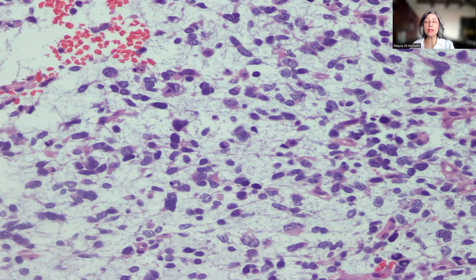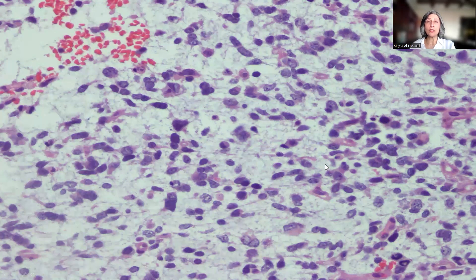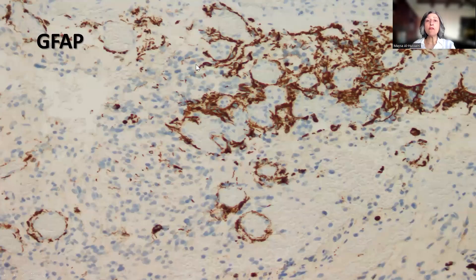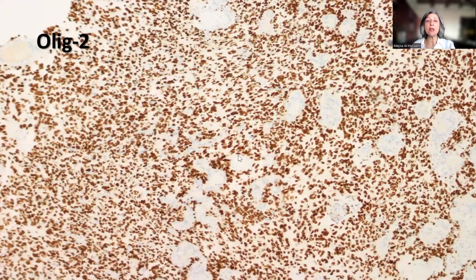There wasn't evidence of necrosis in this tumor, but remember, you do not need to have necrosis if you have microvascular proliferation in order to call a case a high-grade glioma consistent with glioblastoma. The tumor cells showed only focal positivity with the GFAP stain, but were strongly and diffusely positive with OLIG2 immunohistochemistry, with the microvascular proliferation beautifully highlighted by negative staining.